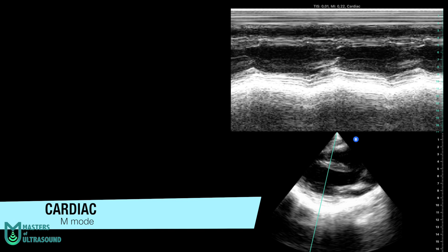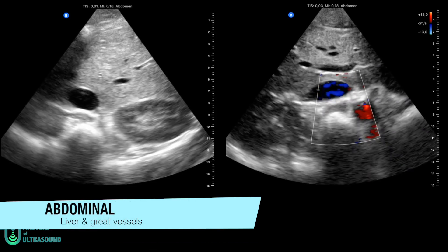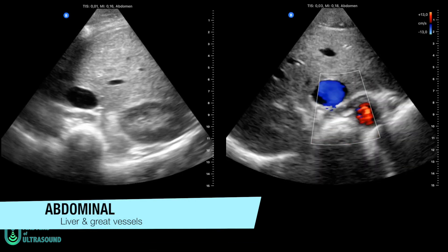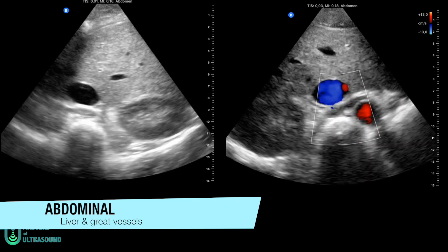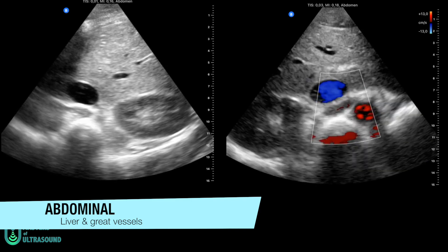Now you're seeing an M mode, just to show that Butterfly IQ has M mode, and here you can see a needle bead screenshot. Here you're seeing the abdominal preset — liver and great vessels — just to show how the liver is displayed and the liver-kidney interface.